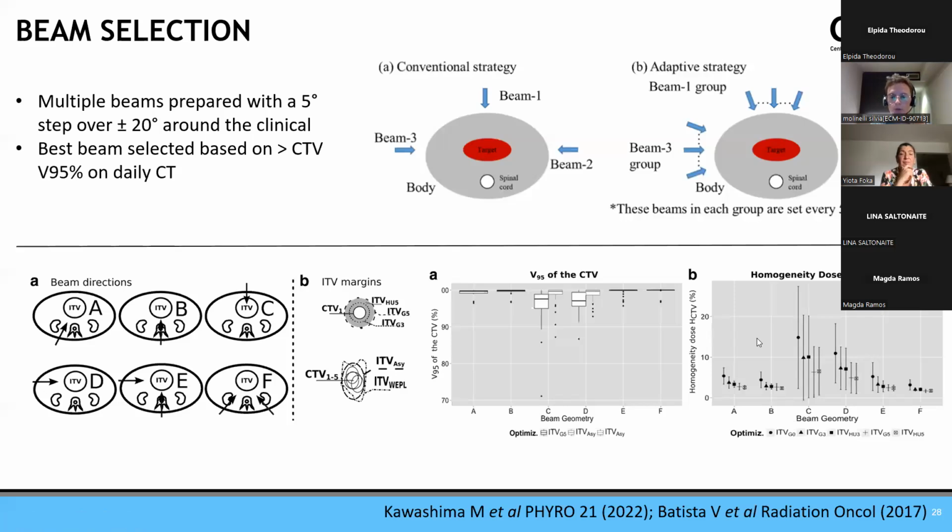Sometimes you don't really have an option. So what we are doing, not having a gantry, not having a cradle, is if we cannot obtain a good plan from the back with the patient prone and with the vertical beam and the beam coming from the liver, we try to use a second positioning of the patient, supine, with an anterior beam and another beam coming from the liver.